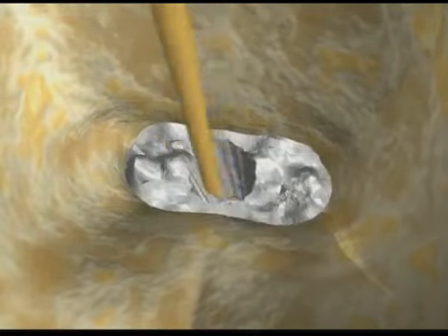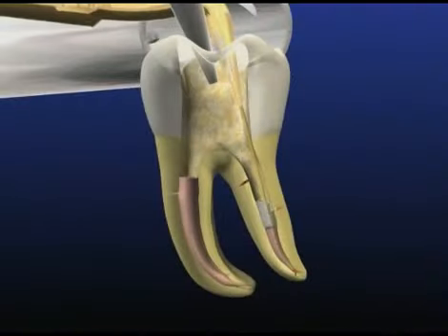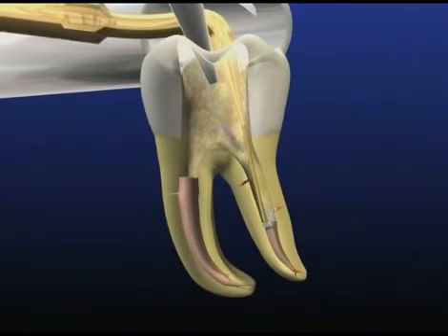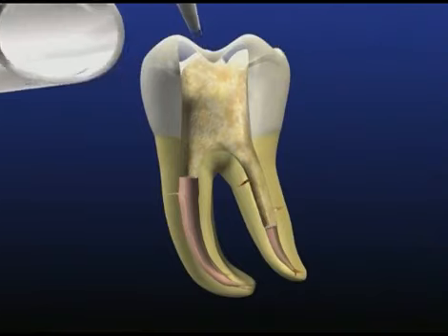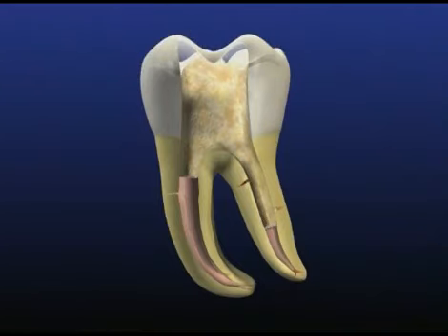Here we see an activated Endo 5 breaking up restorative material and a white MAC tip collimating air to blow out debris. With the elimination of the post, attention can now be directed towards selecting the best gutta percha removal scheme.